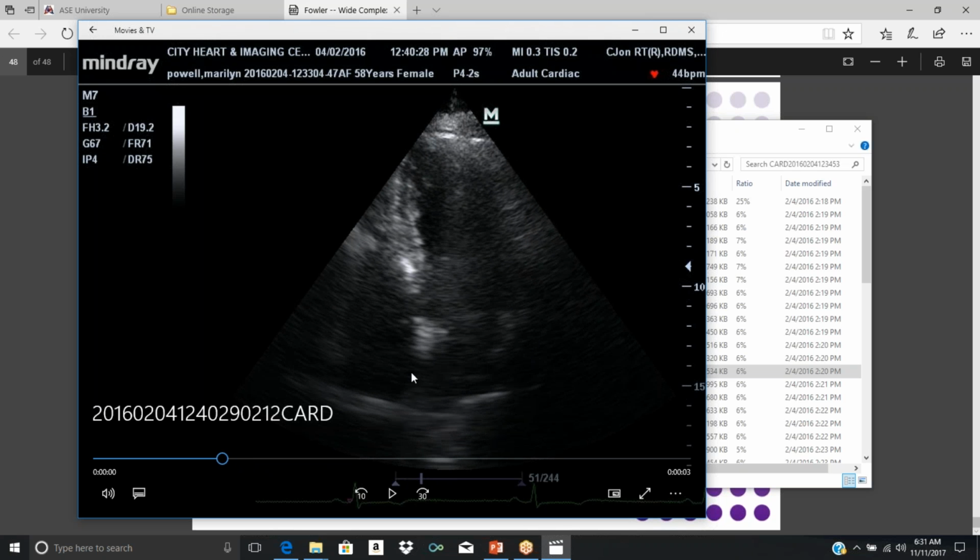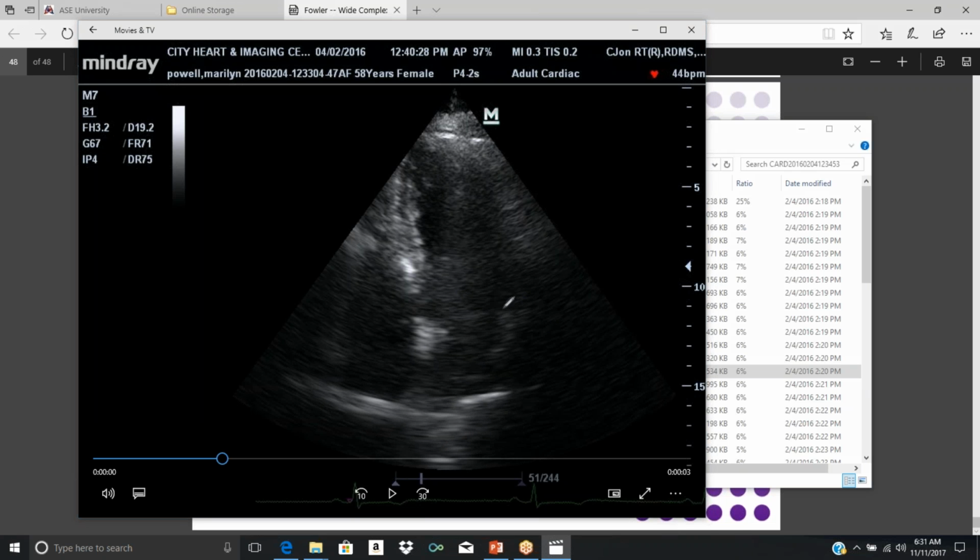Diastole is at the onset of the QRS, so your marker should be at the onset of the QRS, and you do planimetry of the LV cavity size in diastole, okay, and the computer will give you a volume, it will give you an area.